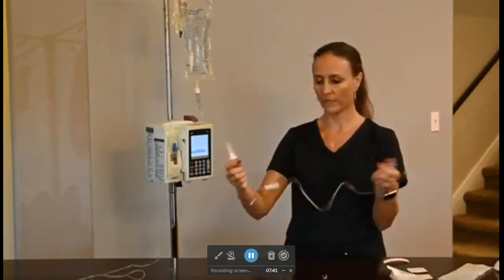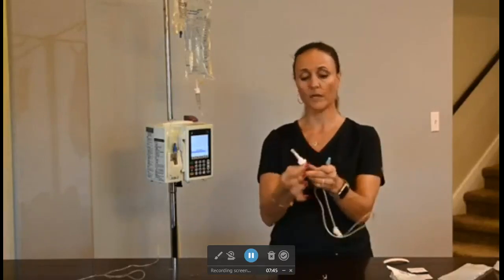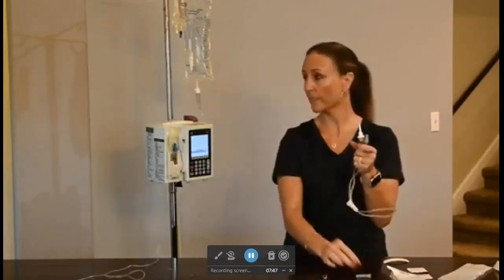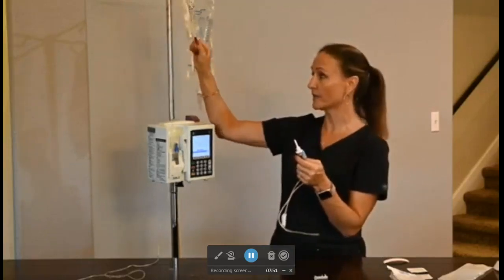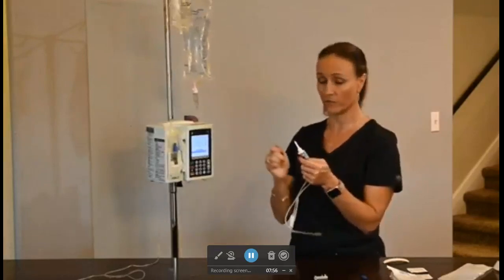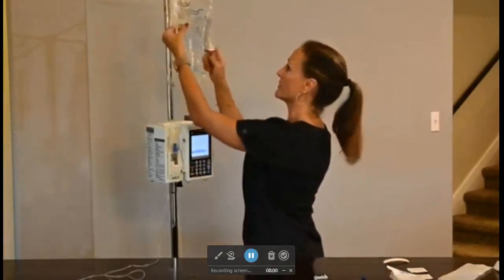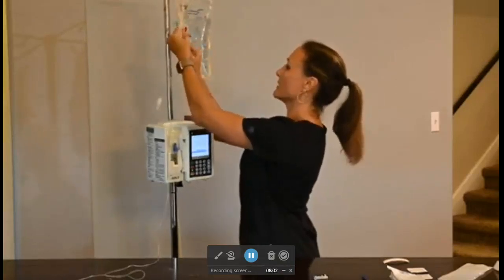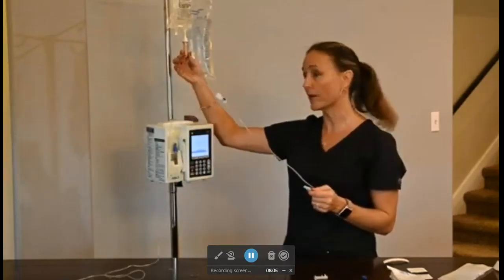Now what I'm going to go and do is make sure that you clamp this, okay? I'm going to take this cap off. I'm going to come over here and do another magic trick. Are you ready? I'm going to pull that, and look at that. Sometimes it's really hard to pull, so just make sure that you're aware of that. I'm going to come over here and again make sure that you've clamped this. I'm going to go ahead and spike it. Now, I'm not going to put anything in this fluid because I'm going to show you in a minute how you're going to back prime, okay?